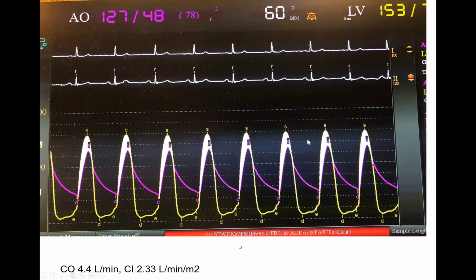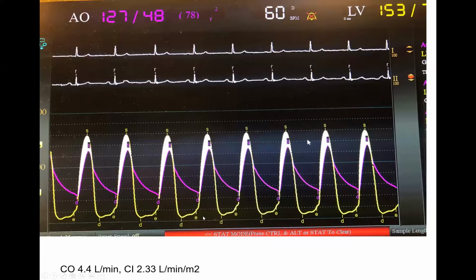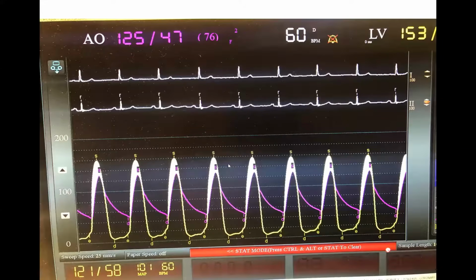I want to highlight, while you're thinking of that, a couple of technical issues you can encounter. Dr. Rosen mentioned those, so I will not elaborate on those. Anybody was asking or saying? Just calculated the valve area, probably 0.9. Very good, very good. Good, excellent. You are correct. But let me explain that and a couple of technical points.